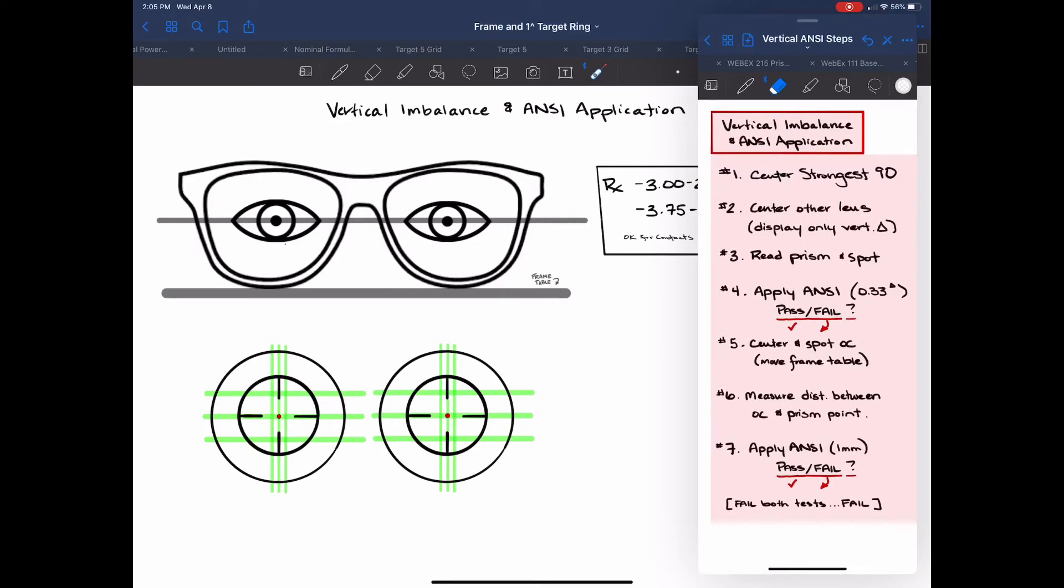In the instructions here we see that the very first thing that we do is center the strongest lens in the 90th meridian and that is because when we actually apply the prism and measure the amount of prism in the glasses we're going to measure that in the weaker of the two lenses. So let's start with that first.